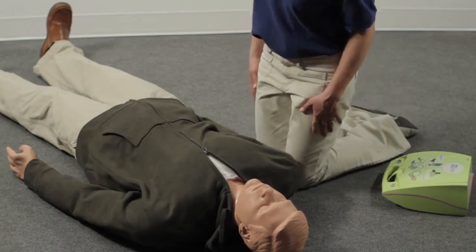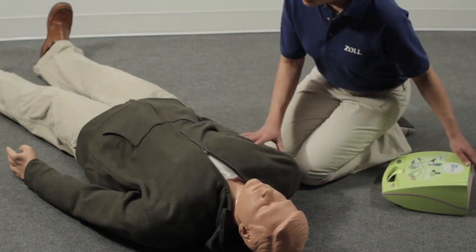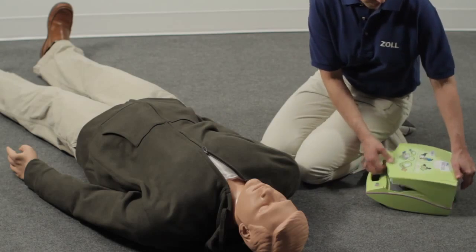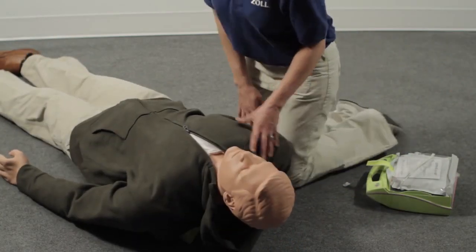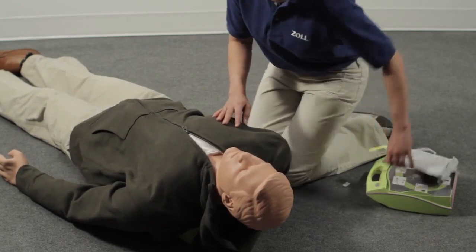Position the person away from contact with water and metal. If the victim's upper body is not injured, use the lid as a support to help keep the airway open — position it between the shoulder blades. Place the AED Plus by the person's shoulder.